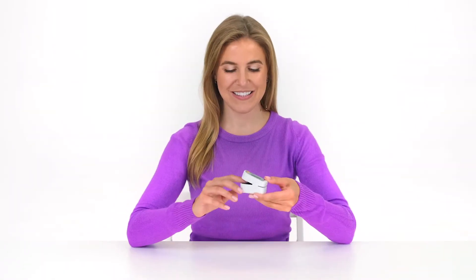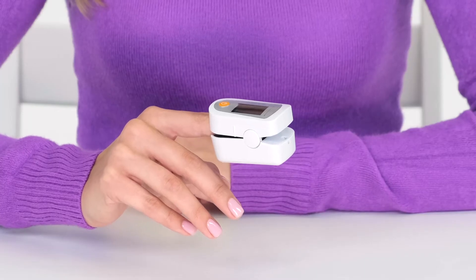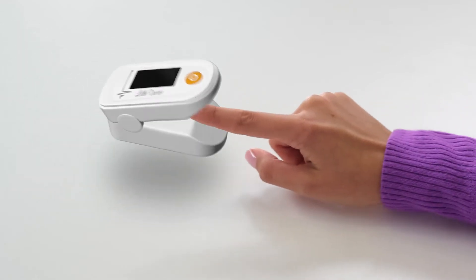Our device is compact and very easy to use. The measurement is performed on the fingertip. All that is needed is to put the device on your fingertip and press the button.